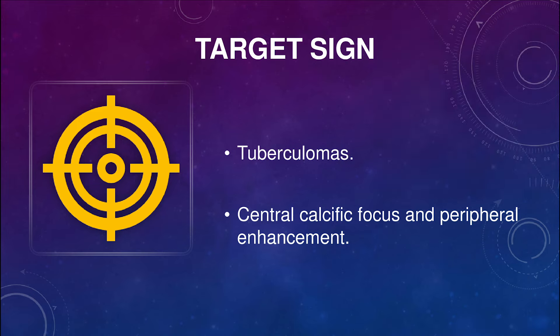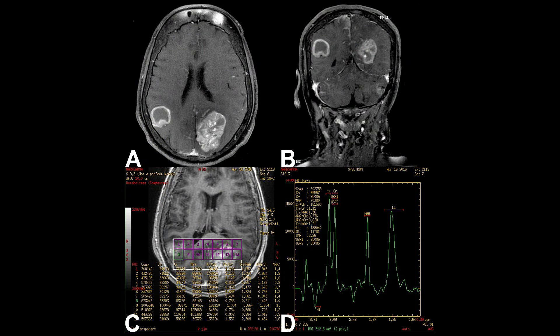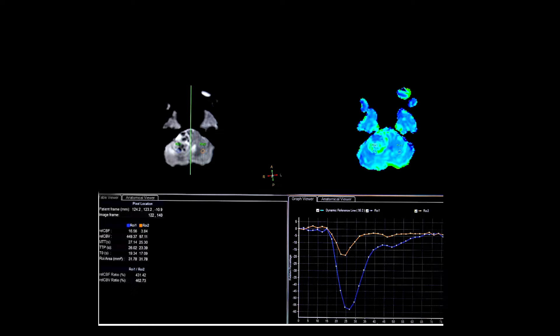The target sign can also be seen in tuberculomas, which shows a central calcific focus with peripheral enhancement. MR spectroscopy in a case of metastasis shows elevated lipid-lactate and choline levels with decreased NAA. A parietal tuberculoma shows elevated lipid-lactate which is greater than choline, with also decreased NAA.